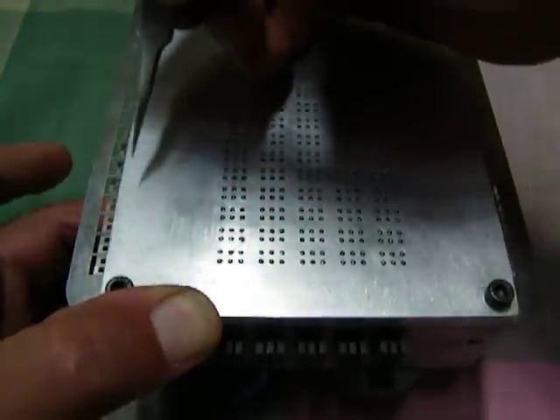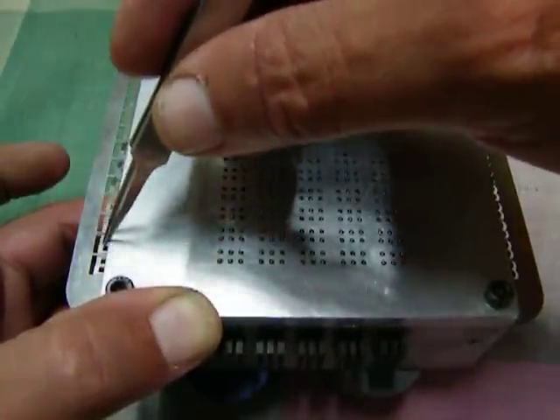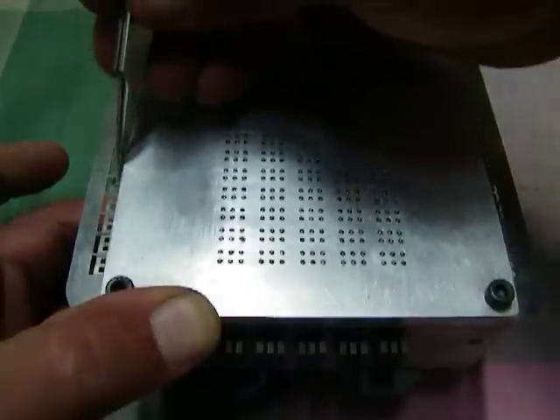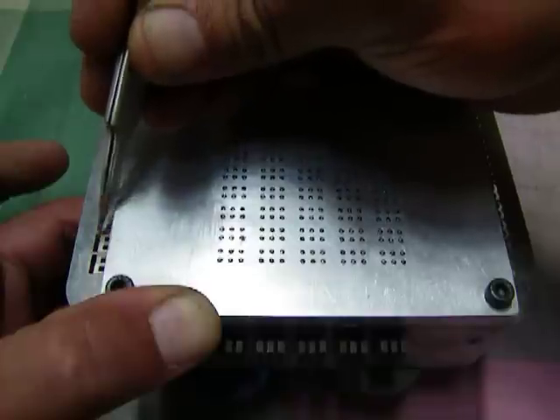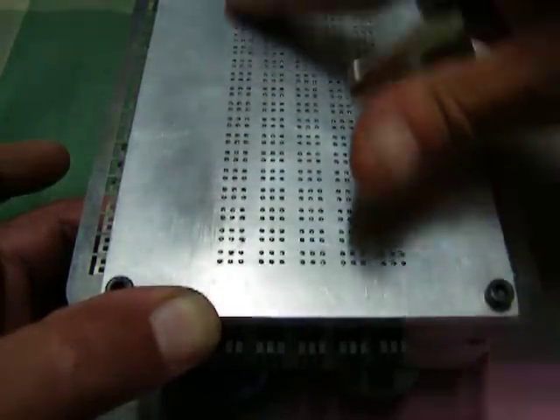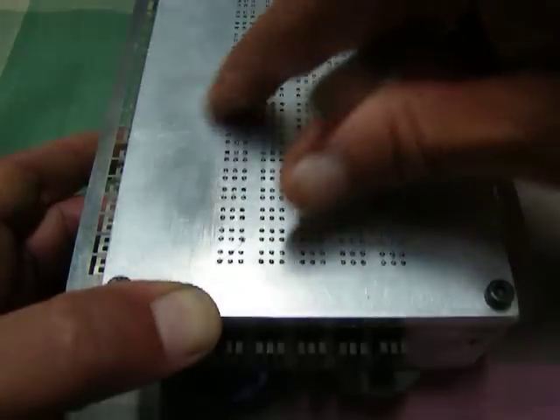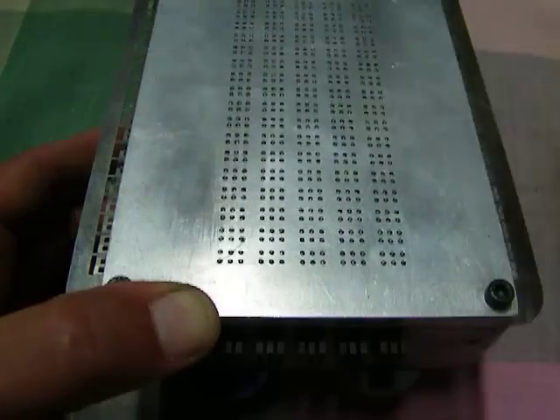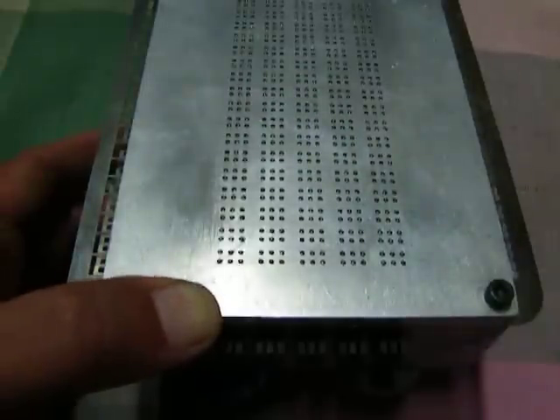Open, closed. So what I've done is, for the first five cells, that's two slides per cell, 2, 4, 6, 8, 10, I've closed them. So basically, all the pins are latched. There shouldn't be any change in the position of the pins over here for the first five cells. After that, from the sixth onwards, you should see all the cells are unlatched, so that you should be able to see this from cell six onwards, the pins jumping up.